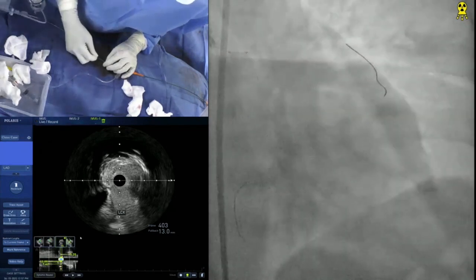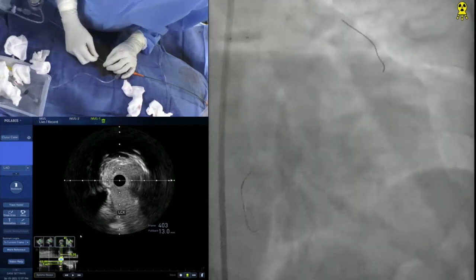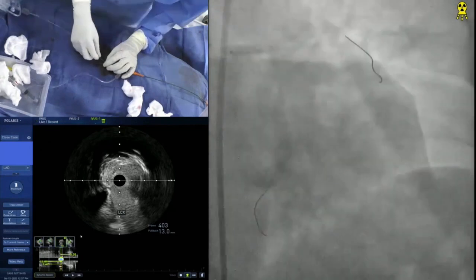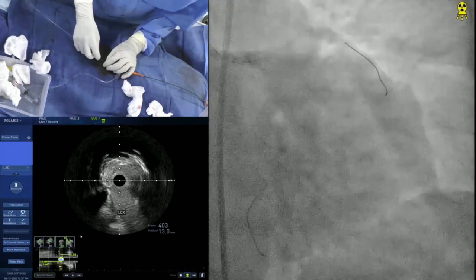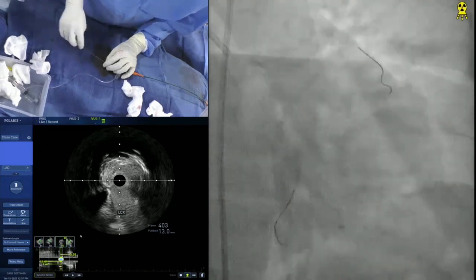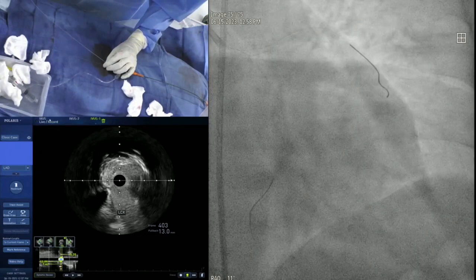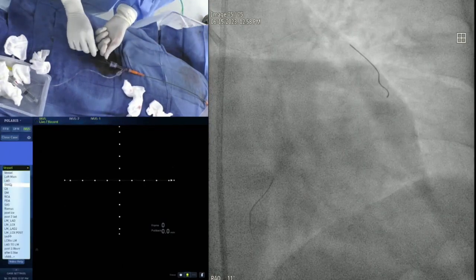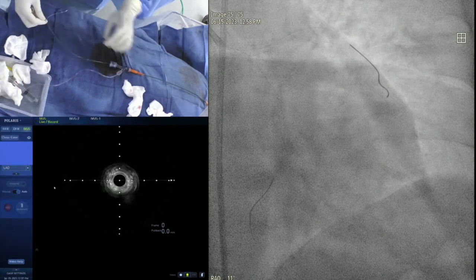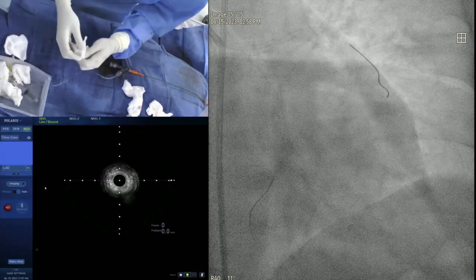Good. It came back a little bit. Right now, what I'm thinking about is recrossing that circ and, if there is some plaque there, giving a little bit of a balloon dilatation at the crossing. There was no plaque there. Let's do the IVUS. We'll do the IVUS now, because of either some spasm or dye angle, but there wasn't plaque there, so unless the plaque really shifted in or something. Maybe not.